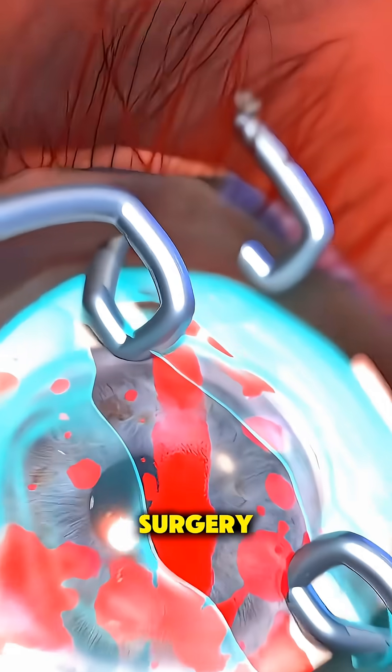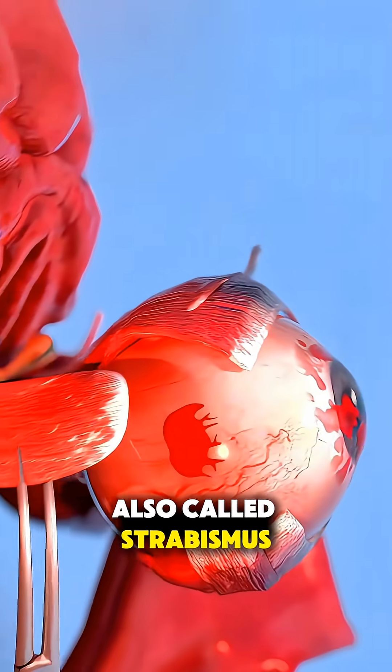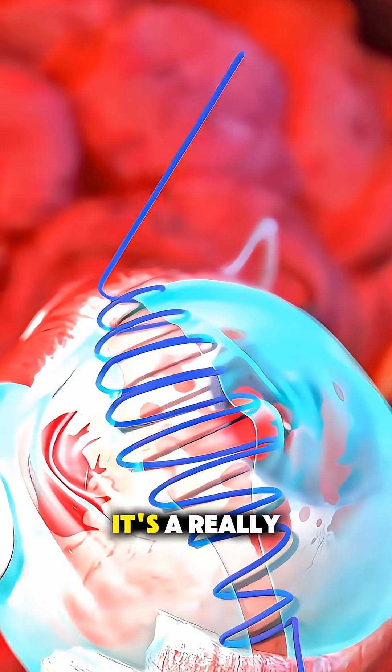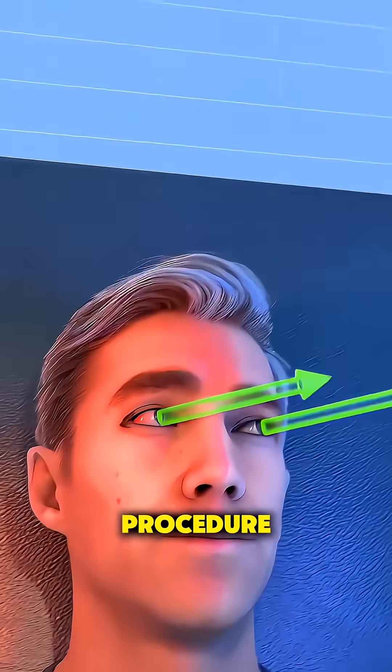Ever wonder how crossed eye repair surgery, also called strabismus surgery, actually works to straighten the eyes? It's a really precise and fascinating procedure.